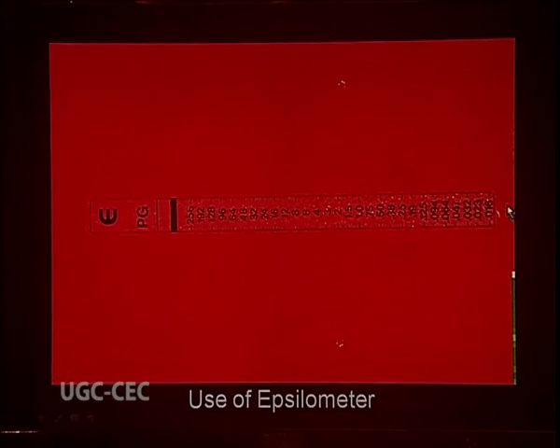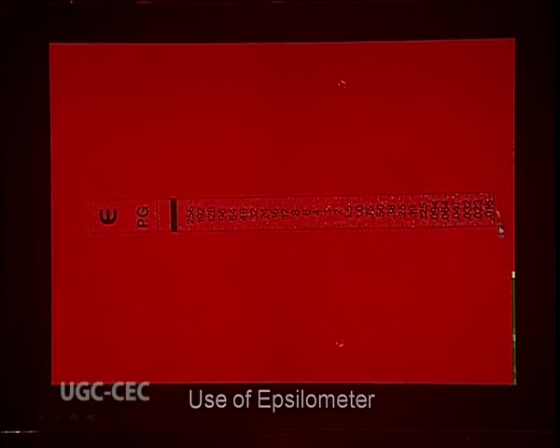Here we can find the concentration gradient is given in one particular strip. An antibiotic is allowed to diffuse and it will create an epsilon-like structure. So from one plate, once again, one plate, one microorganism, but different concentrations of the antibiotic help us to elucidate the MIC, minimum inhibitory concentration.